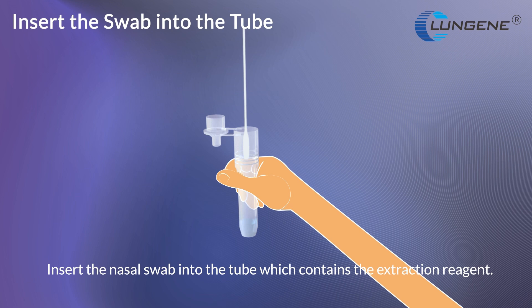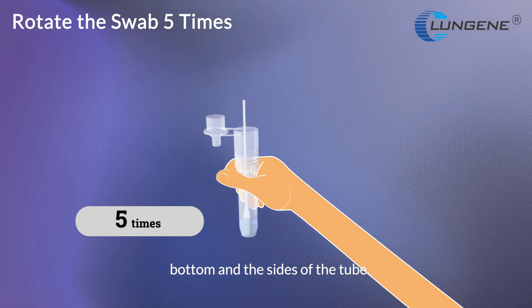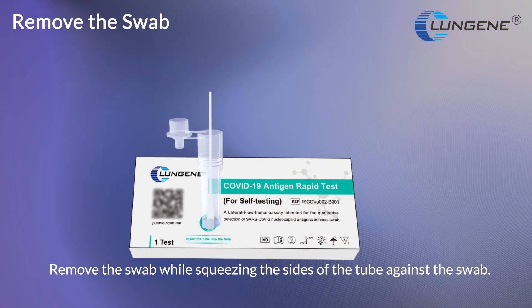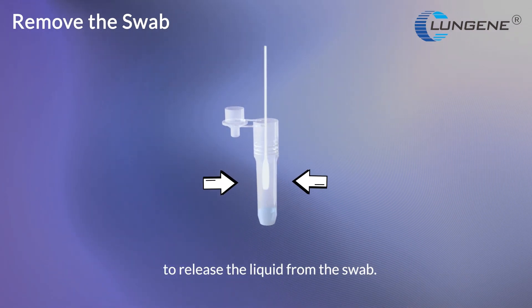Insert the nasal swab into the tube, which contains the extraction reagent. Rotate the swab at least 5 times while pressing the swab tip against the bottom and the sides of the tube. Let the tip of the swab soak in the tube for 1 minute. Remove the swab while squeezing the sides of the tube against the swab to release the liquid.